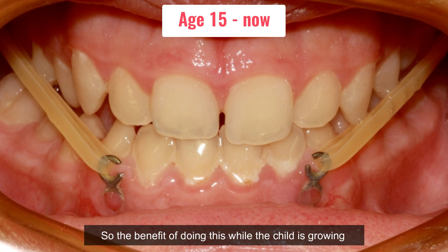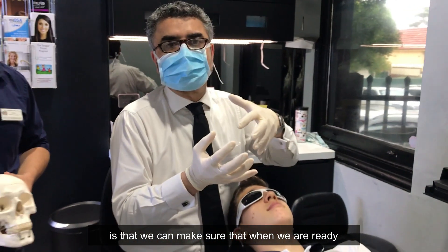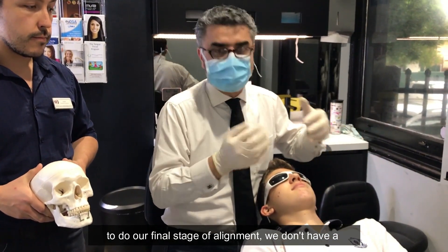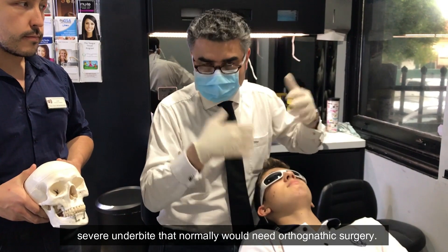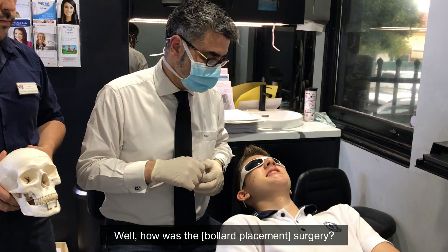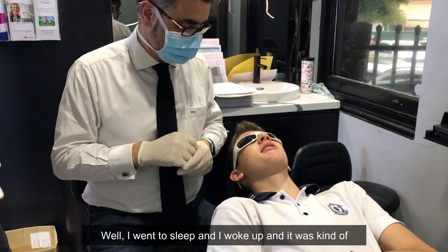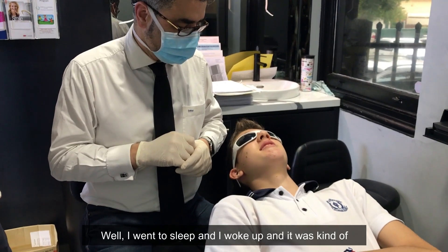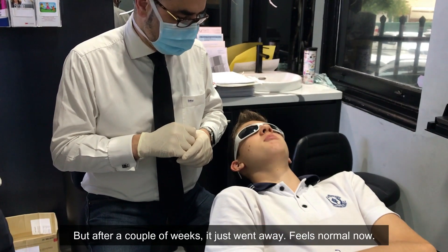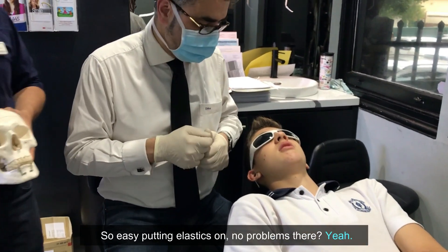The benefit of doing this while the child is growing is that we can make sure that when we are ready to do our final stage of alignment, we don't have a severe underbite that would normally need orthognathic surgery. How was the surgery? Well, I went to sleep, then I woke up and I was just kind of stiff in my mouth because I had stitches and stuff, but after a couple of weeks it just went away.